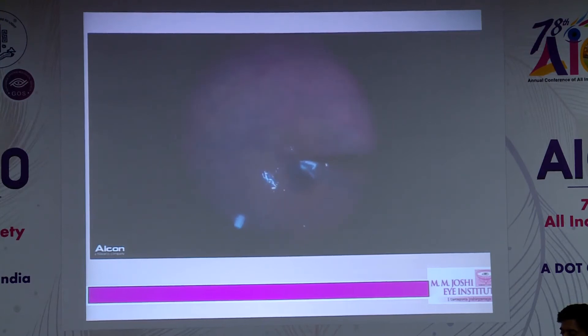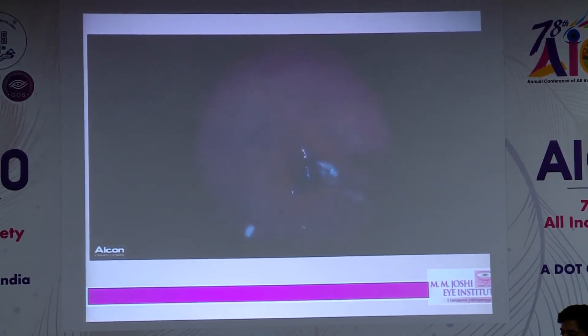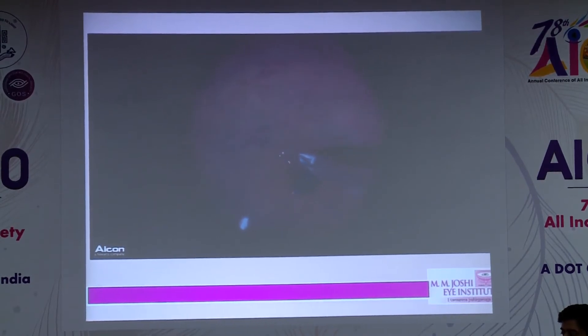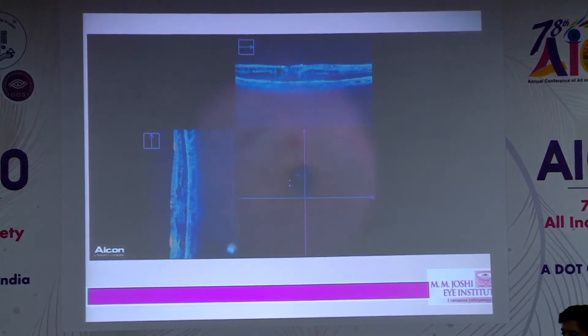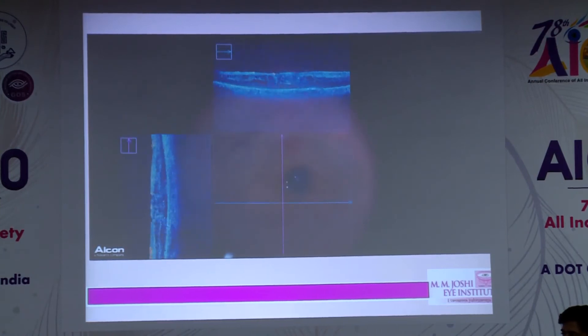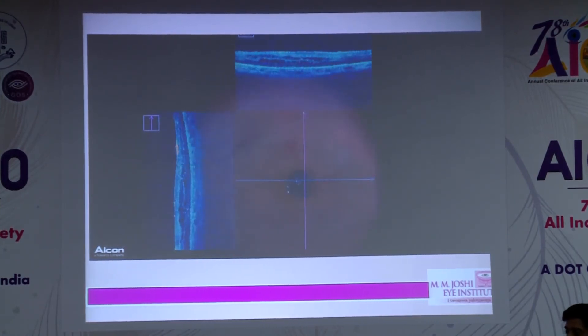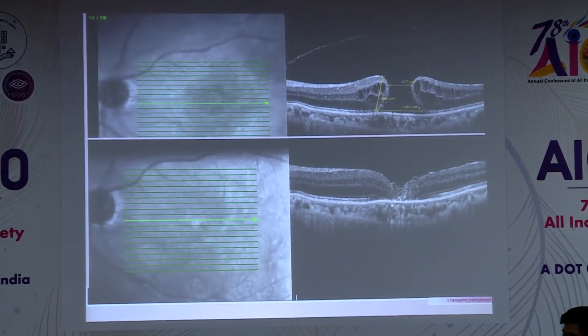The advantage of working under PFO or VISCO is stability — in earlier cases shown during fluid-air exchange, the flaps might slip away, but here there is very little chance the flaps come outside the macular hole. During fluid-air exchange with PFO, I tilt the eye slightly so the PFO moves away from the macular area, then complete the exchange. This avoids unexpected flap dislodgement.